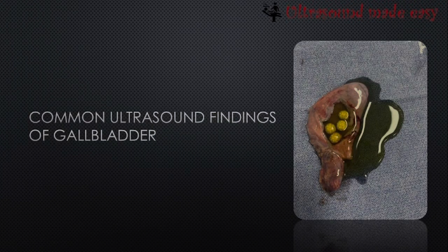Today we will discuss the role of ultrasound in finding gallbladder pathologies. Ultrasound is a very useful tool in finding such cases, and it is non-invasive and easy to use in finding the pathologies related to the gallbladder. In this video, we will discuss how the stone appears, how to find the calculus and polyps, and some other cases that we encountered in the course of our clinical practice. So let's start with the cases.